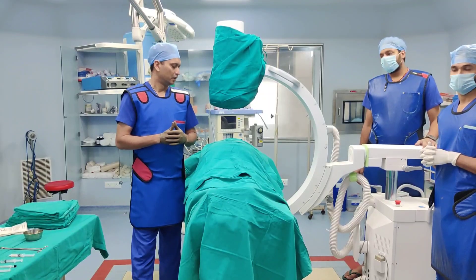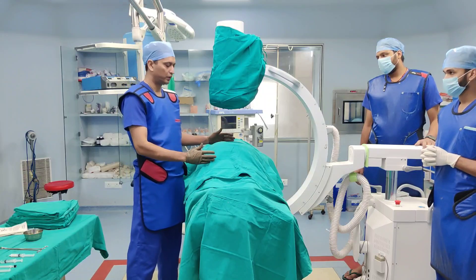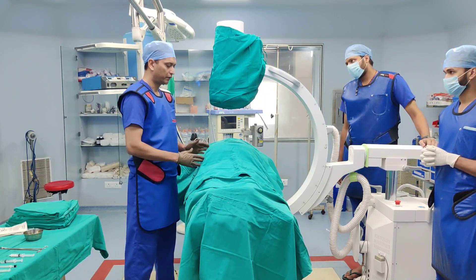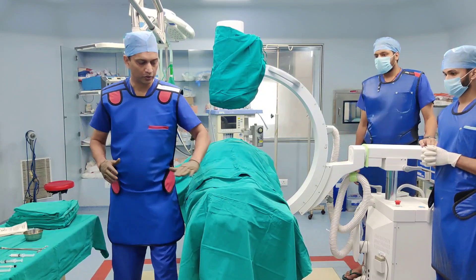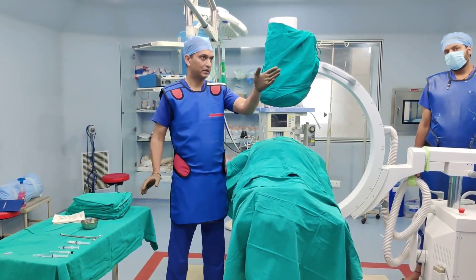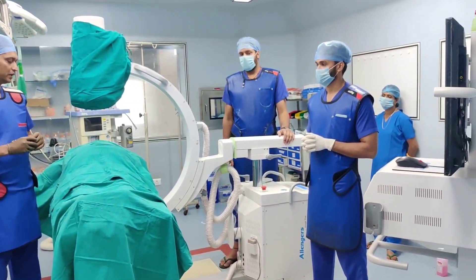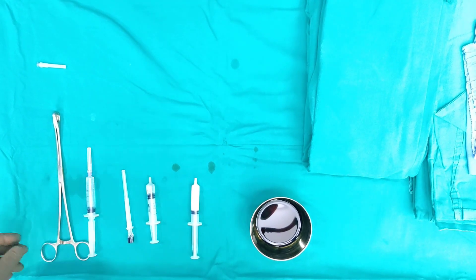This is the theater setup. The patient is going to be prone with a pillow under the front of the abdomen, and the table should be in neutral position. The C-arm is going to come from the opposite side, my trolley will be on this side, and my C-arm screen will be right in front. That is the theater setup for this particular procedure.